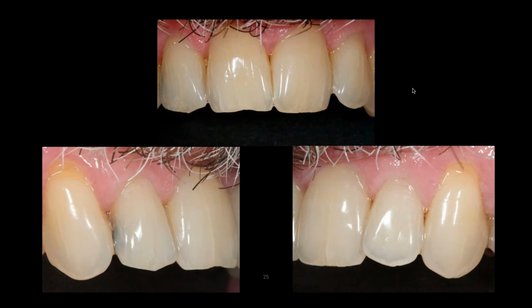The whole idea is if you know about refractive index and how the teeth bend light, the refractive index of natural teeth is about a 1.6 and zirconias are up around 2. And so there's a mismatch there. Zirconia is a lot more reflective. And with some of the 5Y zirconia, you can get pretty close to the teeth.